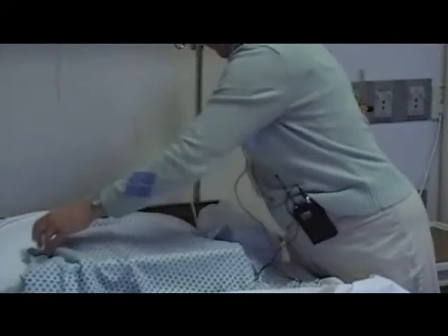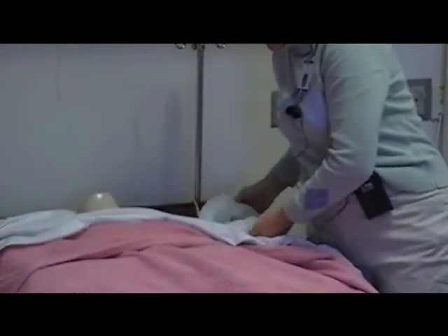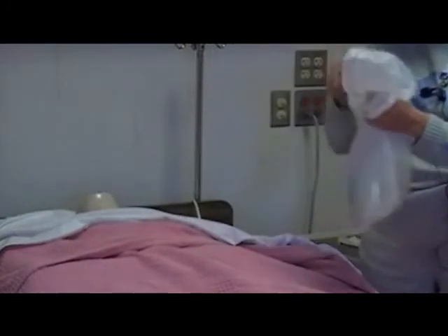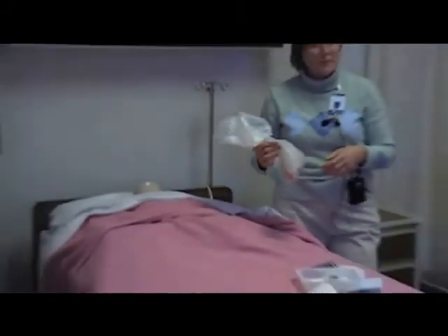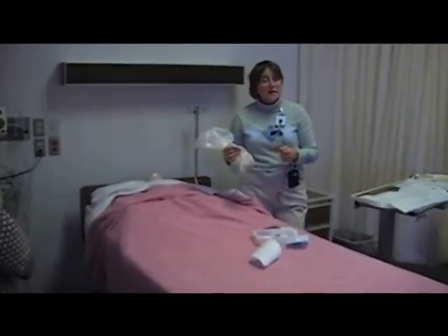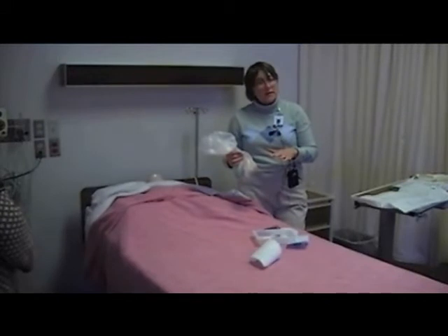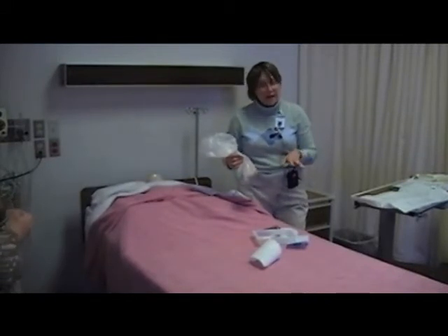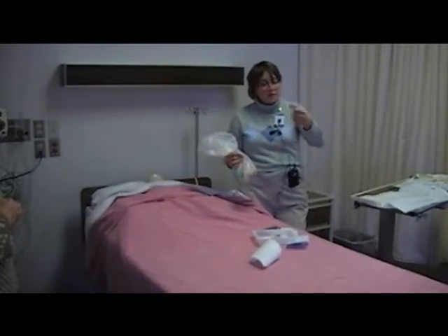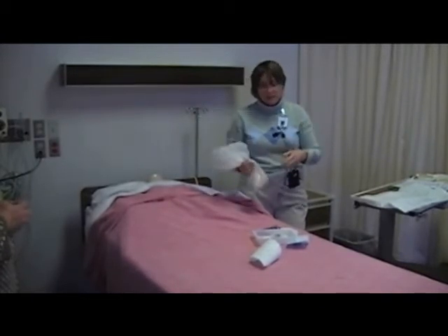Dispose of my items, get him covered back up, get him comfortable, and then I will go. And do you feel that these items would need to be disposed of in biohazard? When do we use biohazard? If there's obvious blood or body fluids. His dressing was clean, there is no drainage, I will not need to use biohazard. If there was a lot of drainage, usually if it's something that you can wring out, you need a biohazard bag. If that were the case, I would have to put this in a red biohazard bag. And of course, gloves to discard it.